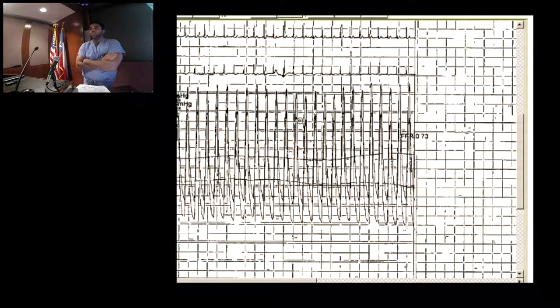There are a lot of cath labs around the country who just use intravenous adenosine. If you have two or three major branches, let's say your lesion is in the mid LAD, there's a big circ that's coming off a little distally, and you have two big diagonals. The argument is made: how much adenosine is actually getting down the LAD, and how much is going into the other vascular bed? So if you give an IV infusion, you are sort of standardizing for everything. You start an infusion, dilate everything, and then you see through the wire what the stenosis is.